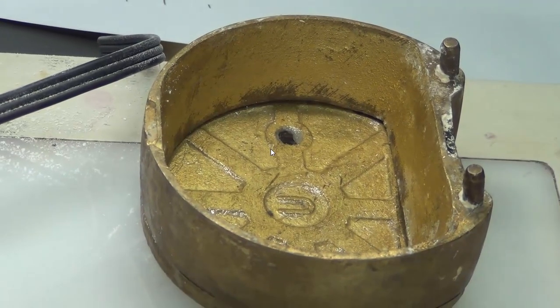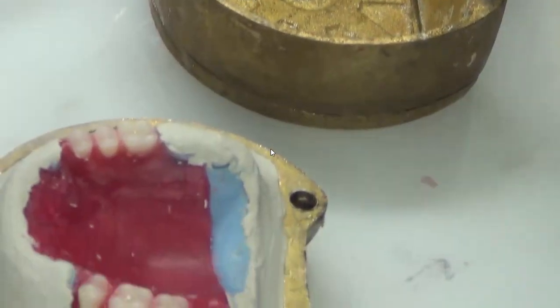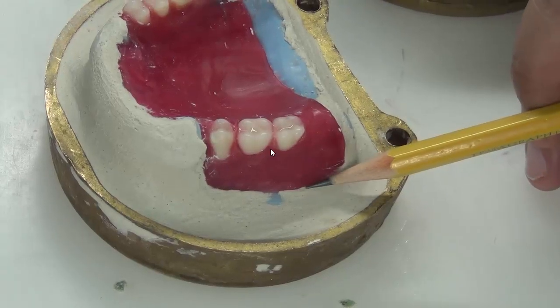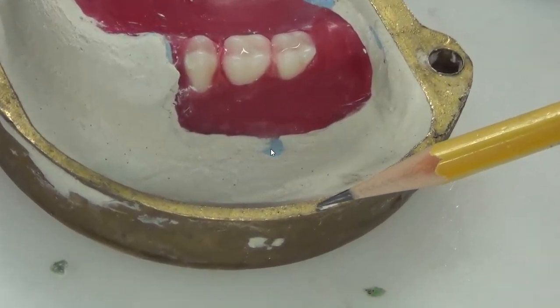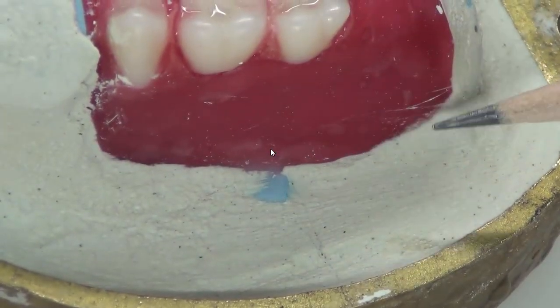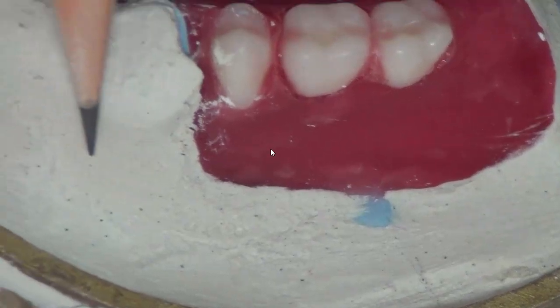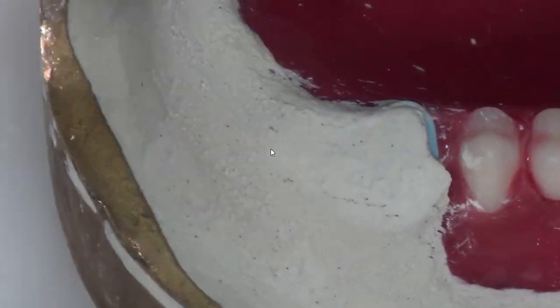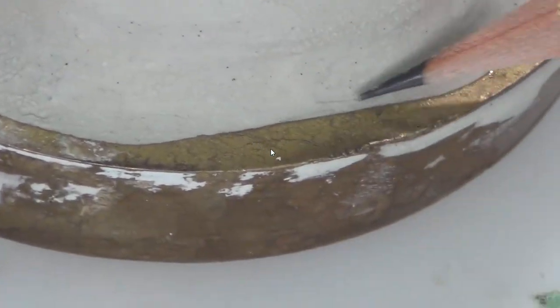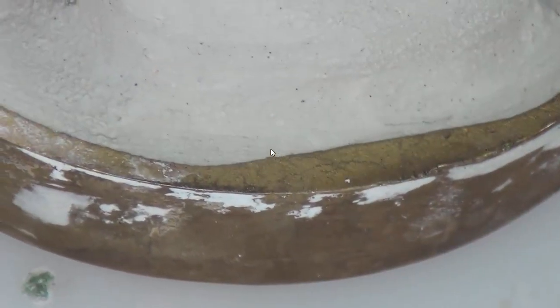Now the next step that we're going to do, I'm going to first check the quality of the work. What we need to see is from the edge of the wax till the rim of the flask, there is a smooth surface. Okay? No undercuts. All wax is clean. All wires are totally embedded in plaster. The rim itself is clean because I'm going to fit the upper rim, so I don't need plaster between the upper and lower rims.